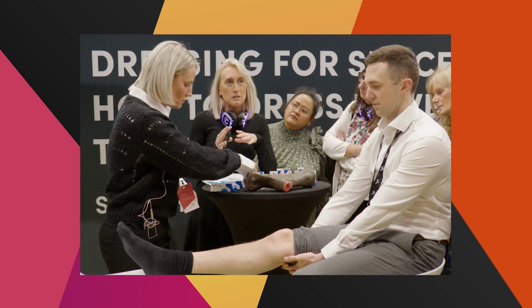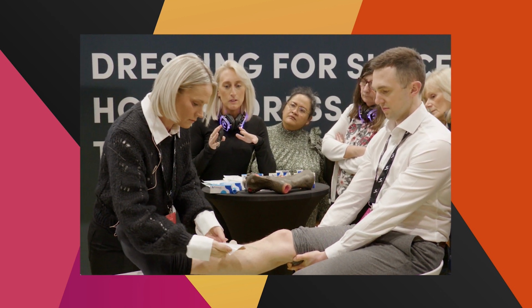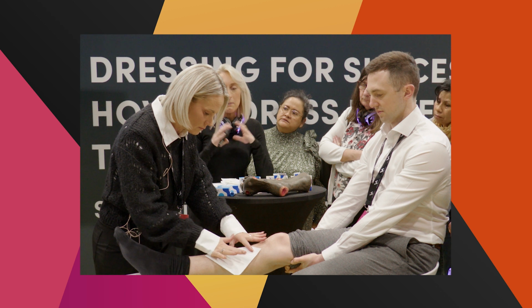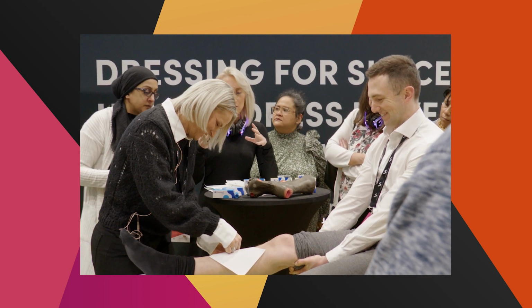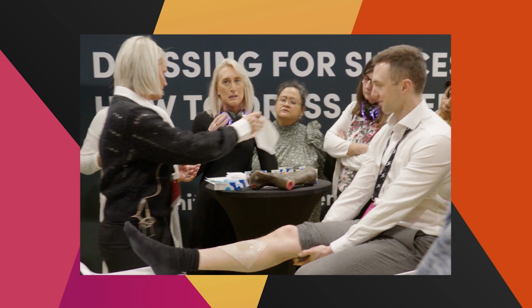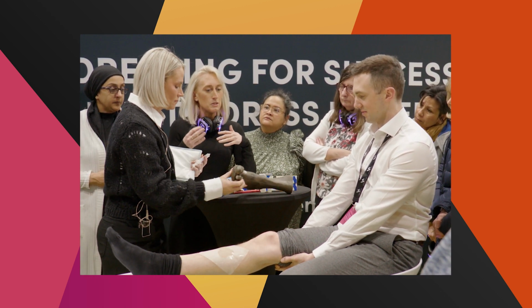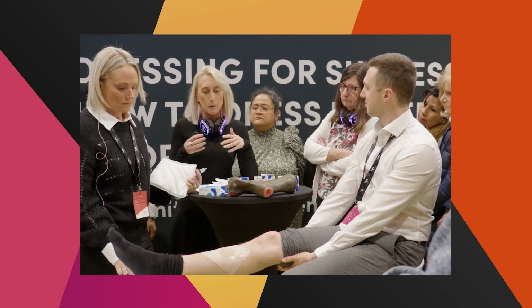So they're both fully antimicrobial. As Astrid's just said, it's an enzyme-based antimicrobial. So you've got the two enzymes stabilised by glycol that produce an oxygen species. With it being an oxygen species, that means it's equipped to deal with all different kinds of bacteria that you've got. You've got the debridement gel, so it'll help keep your wound bed clean, so that when you're doing your observations, when you're assessing your wound, with the continuous autolytic debridement that we've got, your wound bed should be really clean and you should be able to see it completely.